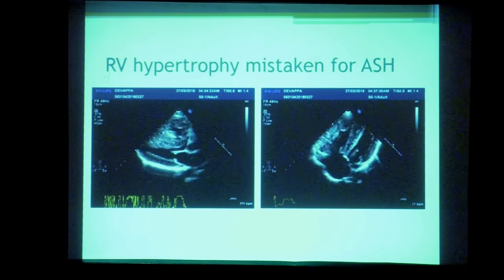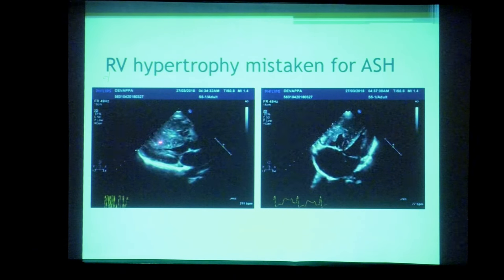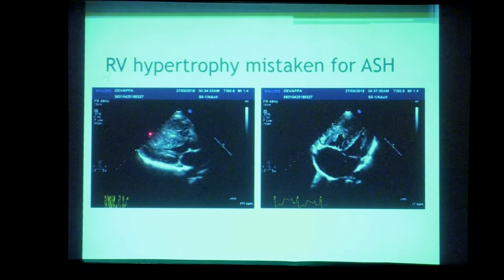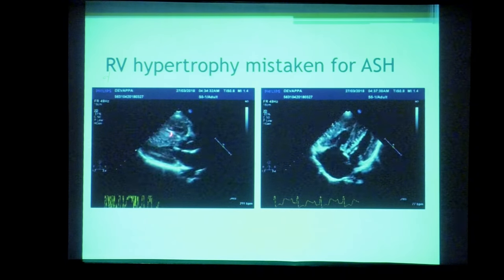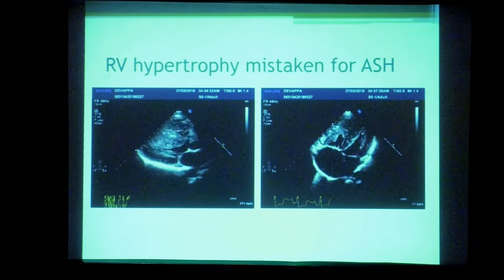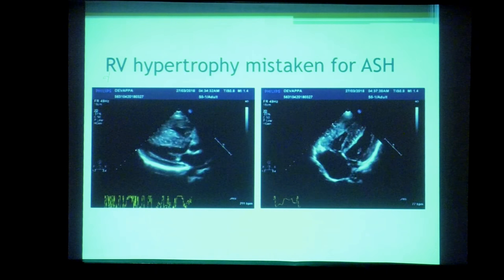This case of pulmonary stenosis with gross right ventricular hypertrophy illustrates why asymmetrical hypertrophy alone is not sufficient to diagnose HCM. Looking carefully at the clip, there is a prominent moderator band with a slight echolucent space separating it from the interventricular septum. If not careful, one could measure the moderator band together with the IVS and conclude there is a grossly hypertrophied IVS. This septal hypertrophy is actually an indicator of right ventricular hypertrophy, not LVH.